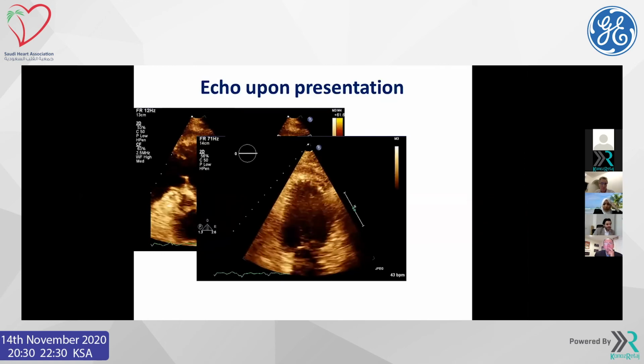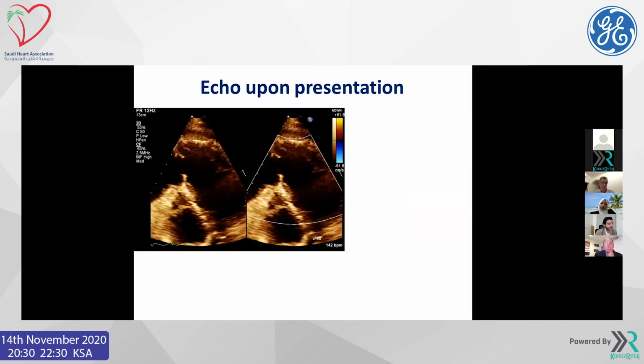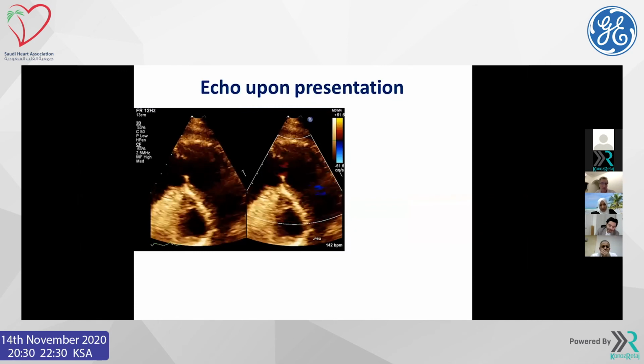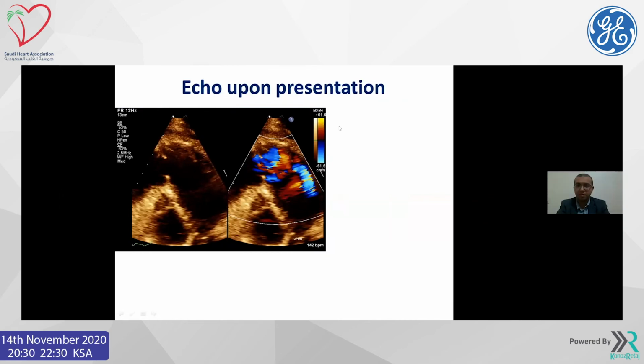Is it going through a septum? What do you think? Is it going to the septum or free wall or where? I think it's going through the free wall. The apex, part of the distal apex, and the free wall around it. So it's not including the interventricular septum, right? No, it would otherwise be a VSD. Yeah, for sure. It's not a VSD. You have the typical to and fro flow through a shelf-like defect.